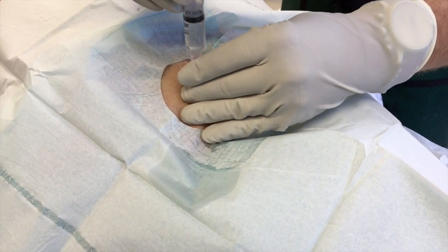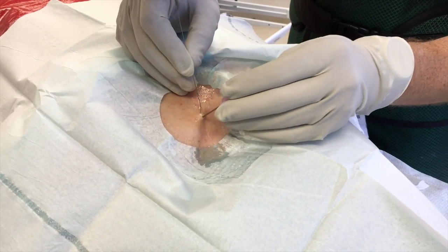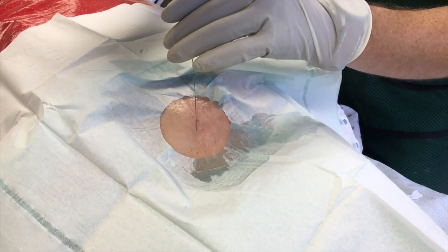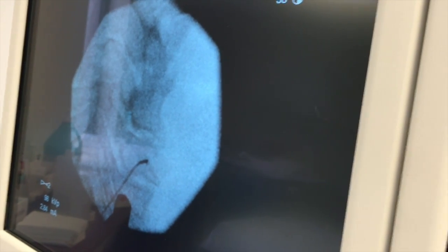So we're making a little portal again. You doing okay? Yes. Do you see my scar down my back? I do, I do. Any pain there? No. Good. No more numbing medicine. Zero to ten, how much pain have you had right now, or through the whole procedure? Zero. That's wonderful. Even the intravenous one, first time — that's good. Our nurses are so fantastic. They've had a lot of experience with pediatric, and if you can get a vein on a child, then you can handle anything. Doing great — a lot of numb in there. Yeah, nothing wrong with that.